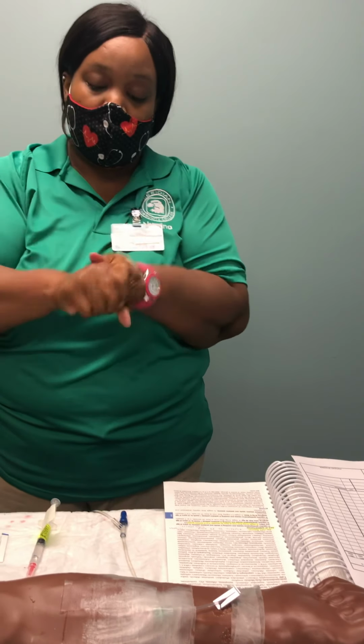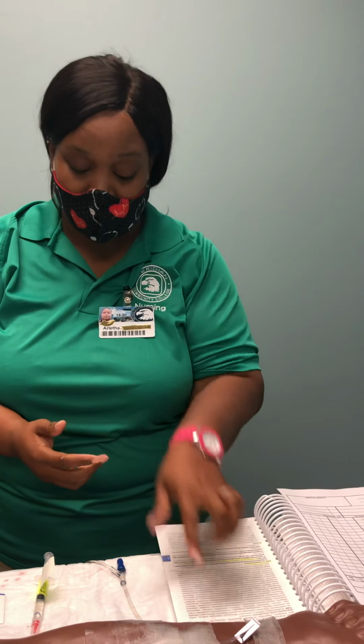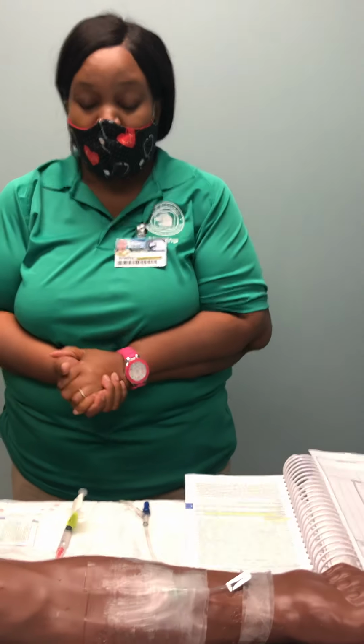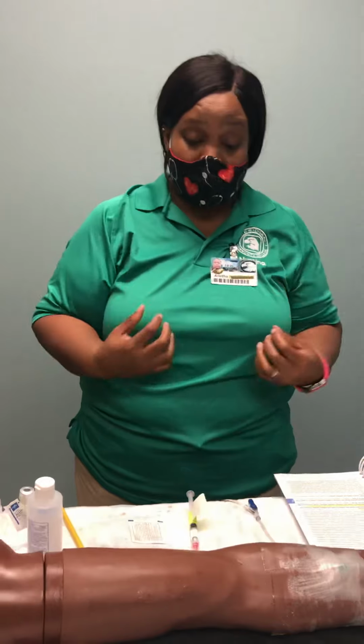Okay. After I do that, I am going to wash my hands. Okay. After I wash my hands, I am going to explain the procedure. I am going to explain that this medication is Zofran, and the doctor has ordered Zofran 2 milligrams IV pushed, which is going to go through your IV line. This medication is for nausea and vomiting. I'm also going to let him know that you may have some diarrhea, headache, dizziness, and if you have any chest tightness or itching, you just let me know. And before you get up, also let me know, because this medication can drop your blood pressure.